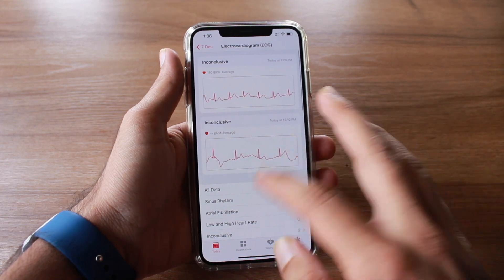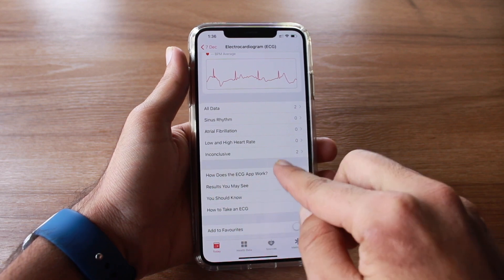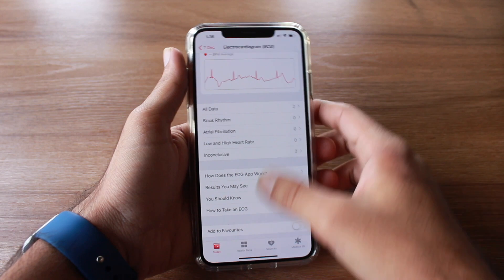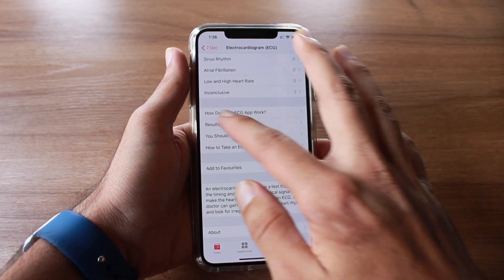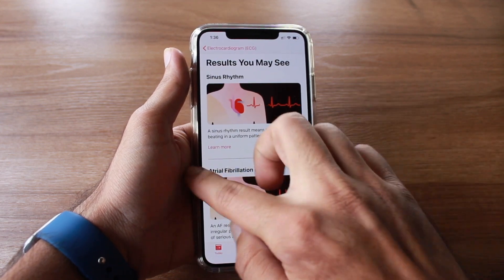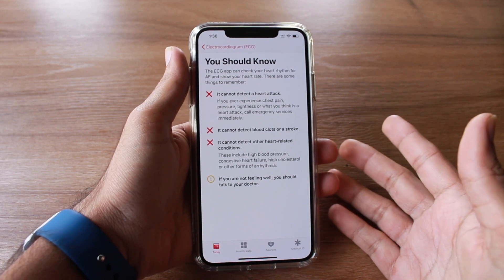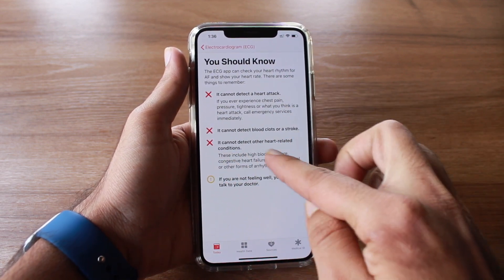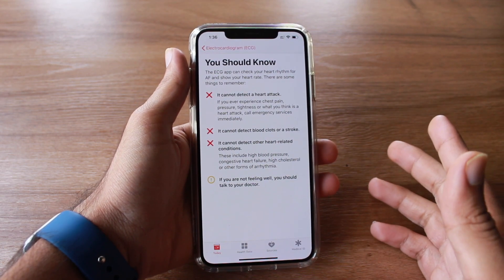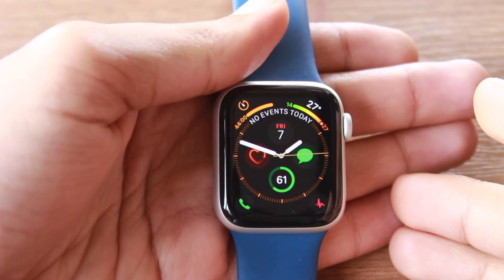In the Health app you have categories including all data — both readings were inconclusive — as well as sinus rhythm, atrial fibrillation, and low and high heart rate. Apple has also noted what the ECG feature cannot do: it cannot detect a heart attack, blood clots, or a stroke, and you should consult your doctor if you face any issues.